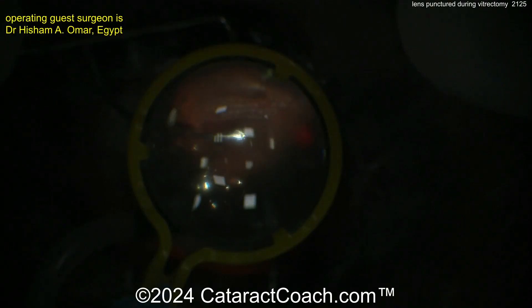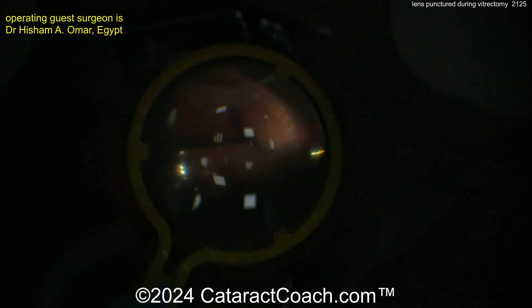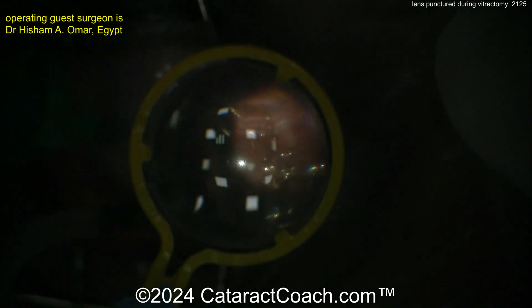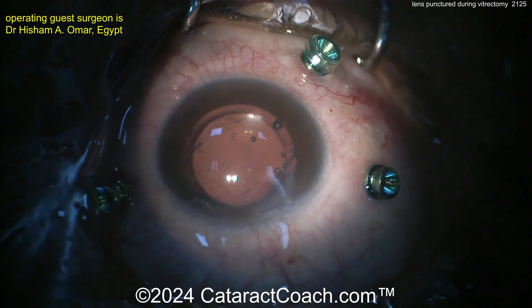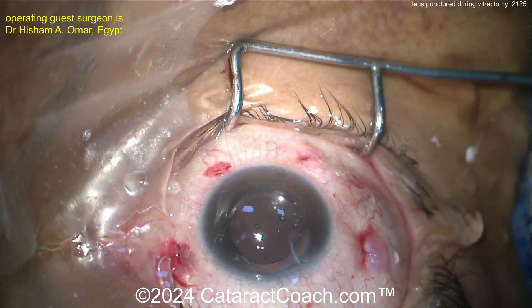Checking out the posterior segment — looks pretty good. Not sure what the indication was for the patient's first vitrectomy, but there are some laser spots in the periphery, so looks like maybe a detachment or something else. Anyway, a nice-looking case — the surgeon reported the patient did very well. That's how you manage this iatrogenic complication.